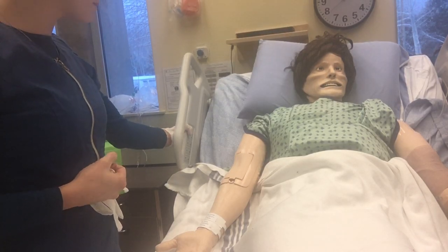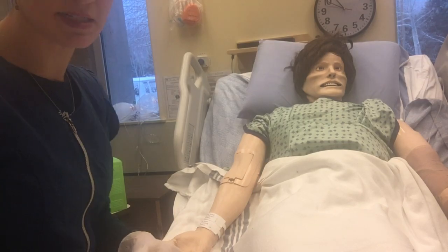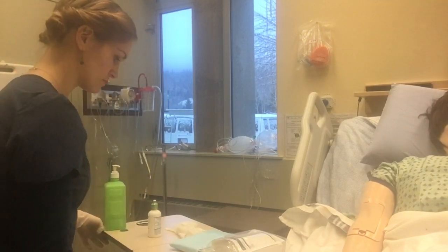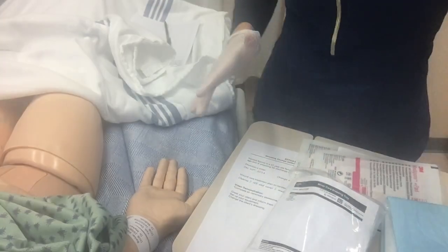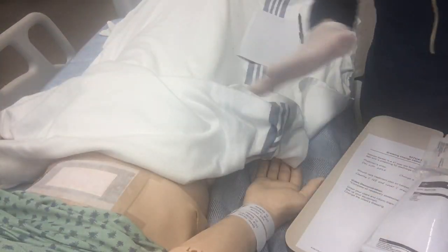Can I get you to say your full name and date of birth for me again? Okay, good. Perfect. Kendall Barker, 1971. I'm going to set up my sterile dressing field facing the client and above my waist to maintain sterile technique. Okay, I'm going to expose just the amount that I need. Actually, I'm going to come over here. So now that I have good access to the wound and she's all set up and ready to go, I'm going to set up my sterile field.